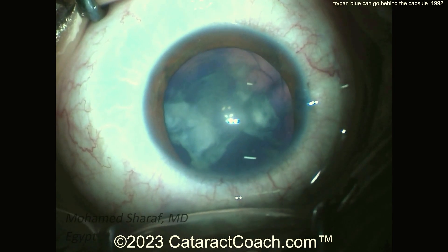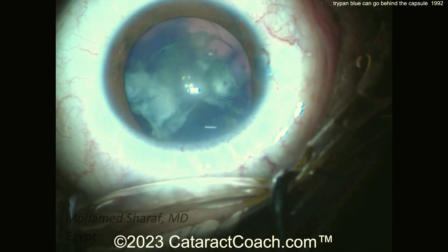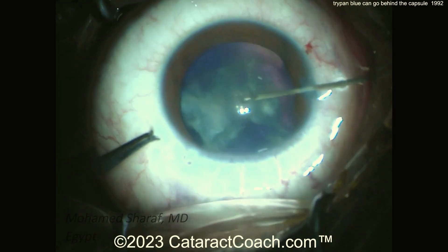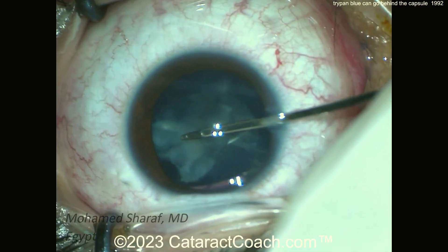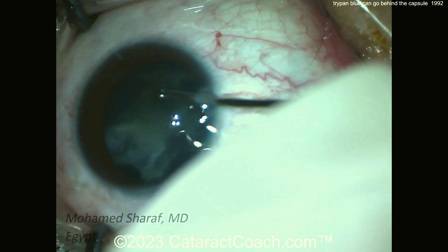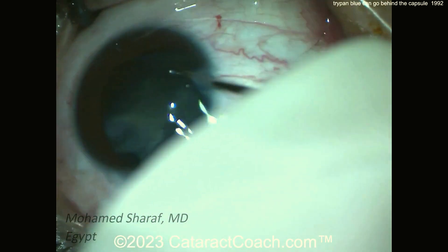Look at the three light reflexes on the cornea — there is definitely coaxial lighting. Now there's a little bit of a red reflex, but not a whole lot. When the cornea light reflex shows just two lights, that means only coaxial. Three lights means coaxial plus paraxial. Now using micro forceps, the capsulorhexis (REX) is done.